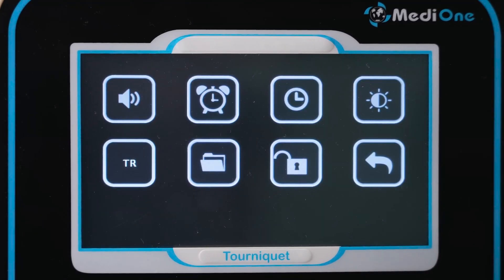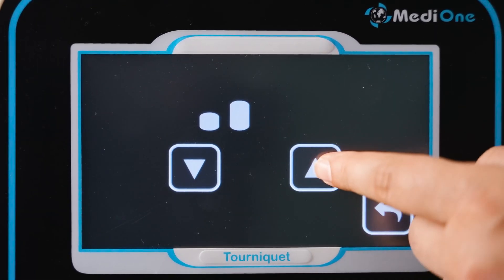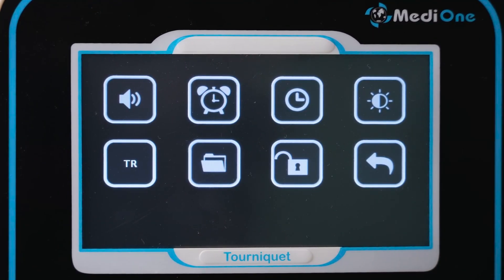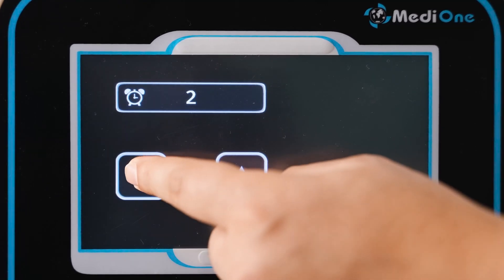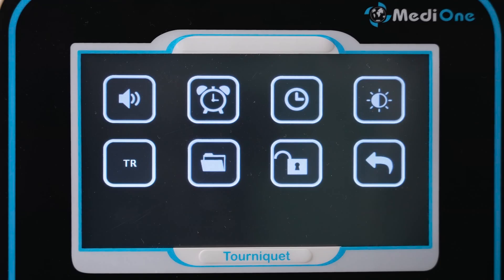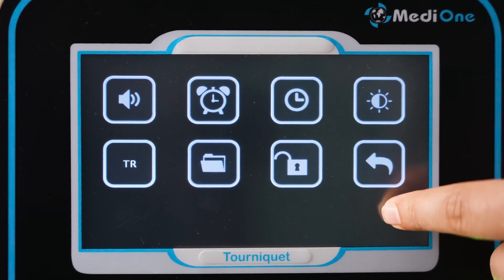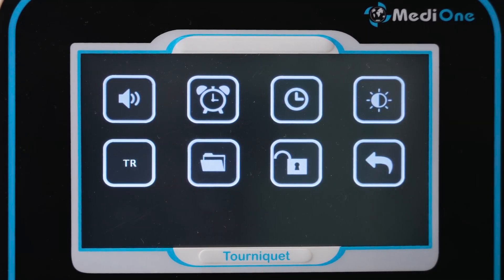Click the settings icon to enter the general settings. There are eight different settings here. The first icon sets the alert volume. The second icon is used to set the device to give a warning a certain number of minutes before the operation ends. Even if the set time expires, the device does not automatically deflate the cuffs for safety reasons. The third icon opens the date and time settings. The fourth icon opens the screen brightness settings. The fifth icon changes the language of the device. The device has two languages: Turkish and English.